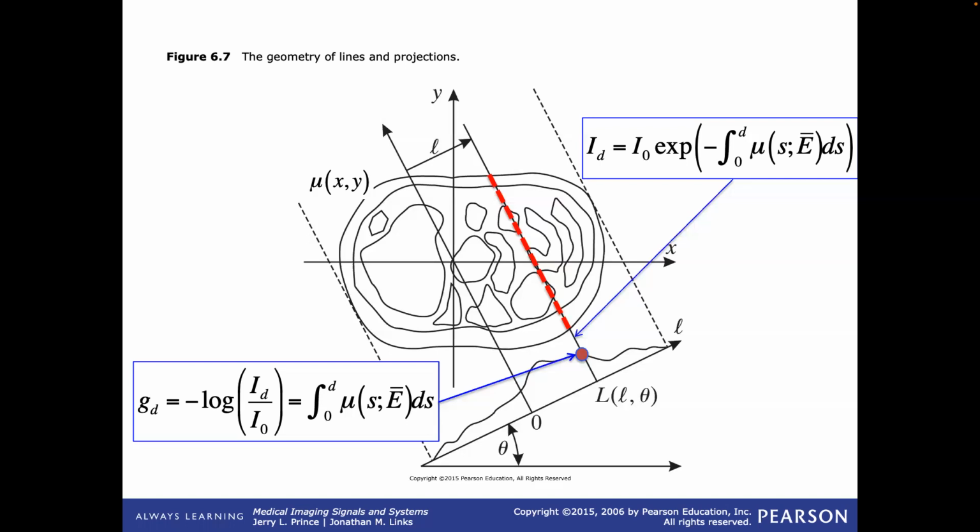And then you can dial up the current that is the electrons hitting the target. So if I say have my current at 100 milliamps, so it's 100 mA, then so many electrons per unit time will hit the target, so many X-rays per unit time come out. I can double that to 200 and I get twice as many.